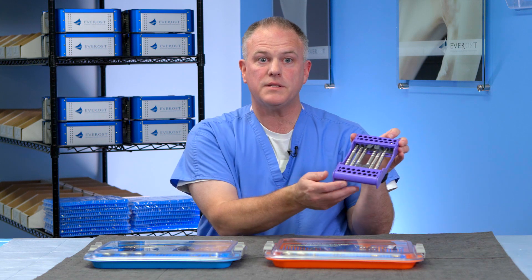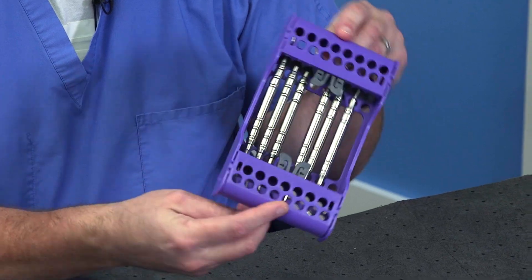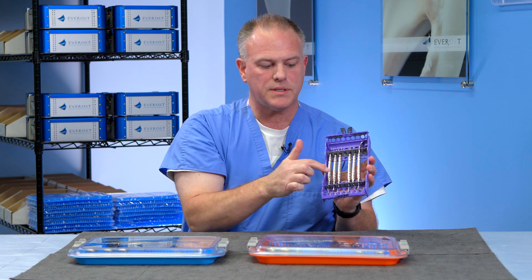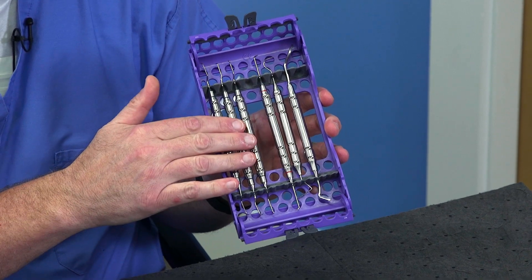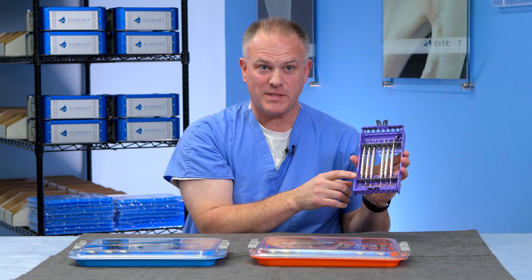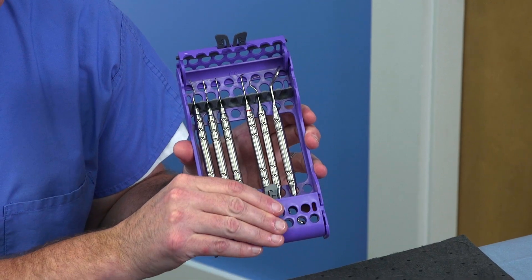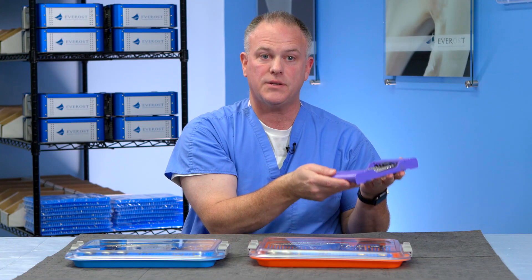The purple kit is the periodontal instrument kit. It comes in this plastic container which holds these delicate instruments very securely. Opening here and here reveals the instruments, which are held in silicone rubber so they don't slide around and remain well organized for their use. Once cleaned and returned to the kit, the bottom snaps securely as well as the top, and this entire kit is autoclavable.